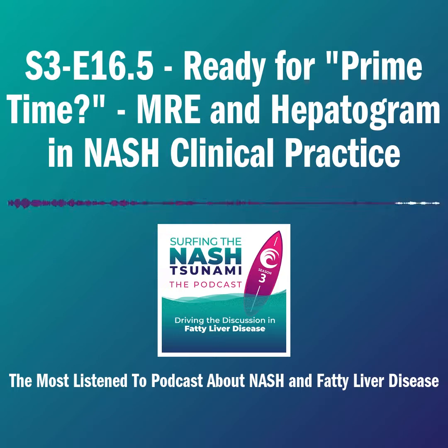That being said, it still is a precious resource. There are about 2,000 MRE units out there that we know of, but I would add that there are about 25,000 MRI scanners in the United States, and so there's a long way to go in terms of disseminating this technology. There's probably more versions of the PDFF software out there as well, and in fact, it's actually one of the most commonly adopted software on all of the major vendors, and so PDFF is already widely available, and MRE is slightly behind, but it is coming up very quickly.